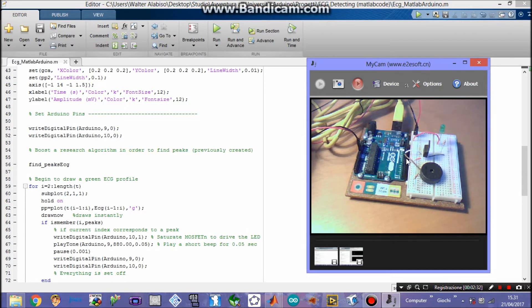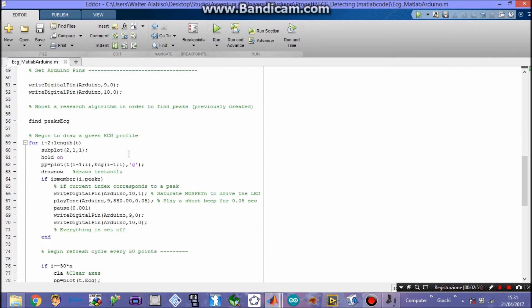The piezo is linked to pin 9 and the transistor is linked to pin 10. First we need those to be set off, so we write digital pin 0 — a logic 0 — to both pins. Next we have to find peaks, and here's an algorithm that I created separately from the rest of this function, which returns a vector whose components are the indexes of ECG peaks.